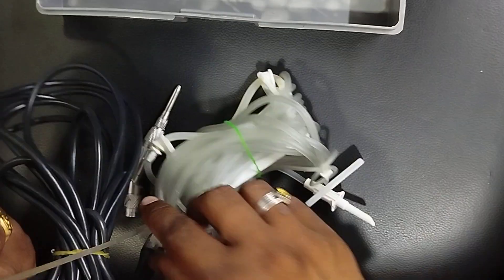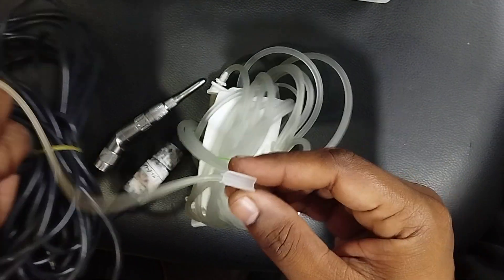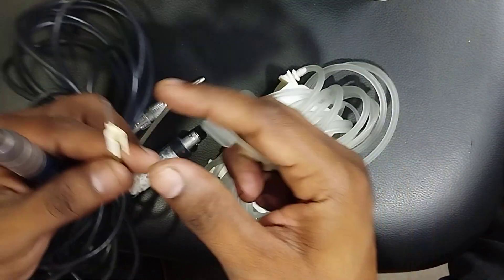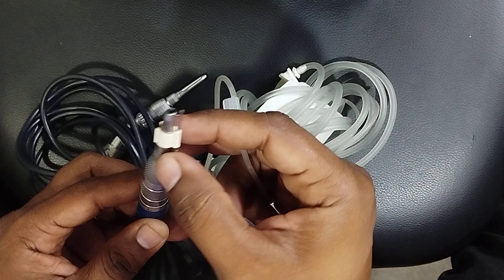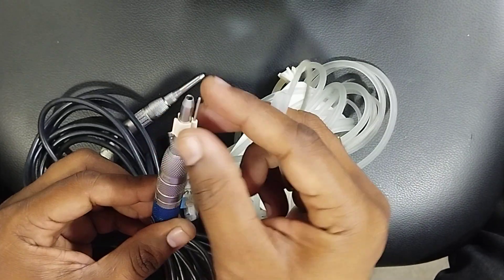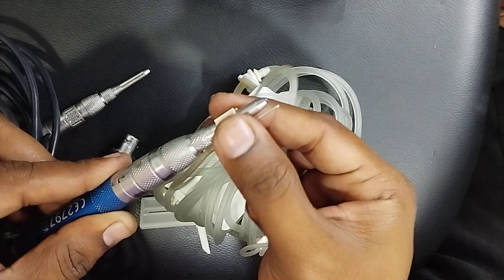The other end — the instrument end — we are going to connect to this motor. On this end, you can see there is a small adapter and a small connector. I'm going to put it in like this. You can position it based on where you need the irrigation.